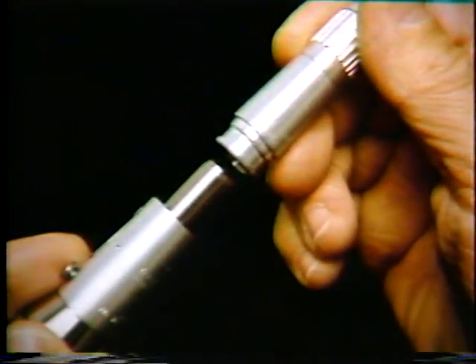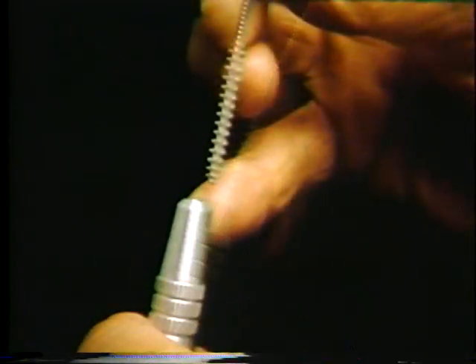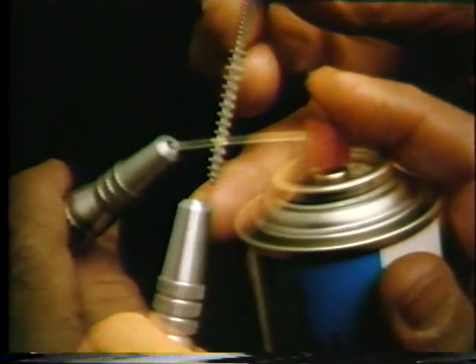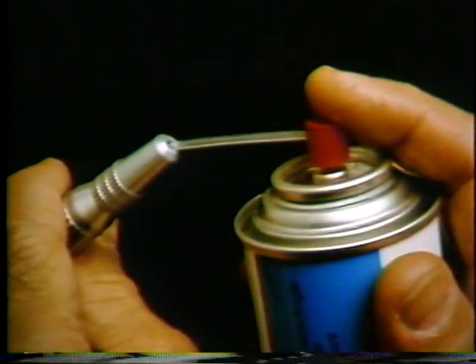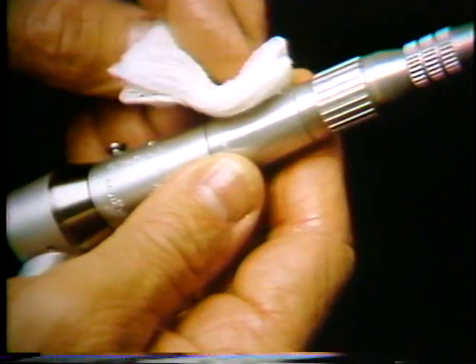Once a week, you should remove the attachment from the motor and spray spray-a-day into the nose. Then run the brush provided in your handpiece kit straight in and straight out of the nose of the attachment. Continue putting spray-a-day into the nose and using the brush until the brush comes out without any debris. When it's cleaned out, squirt a little more spray-a-day into the nose and leave it in. Mount the attachment with a burr installed and run the motor to discharge excess lubricant.